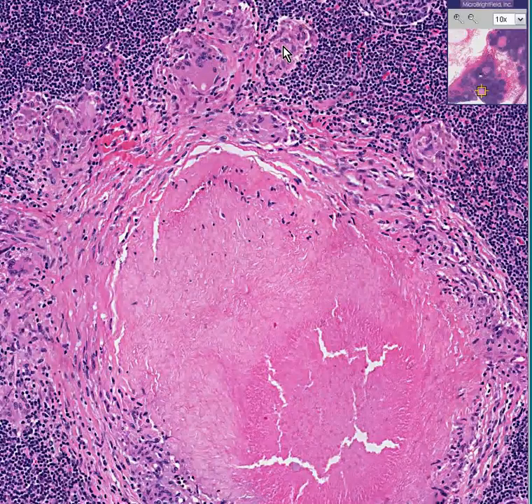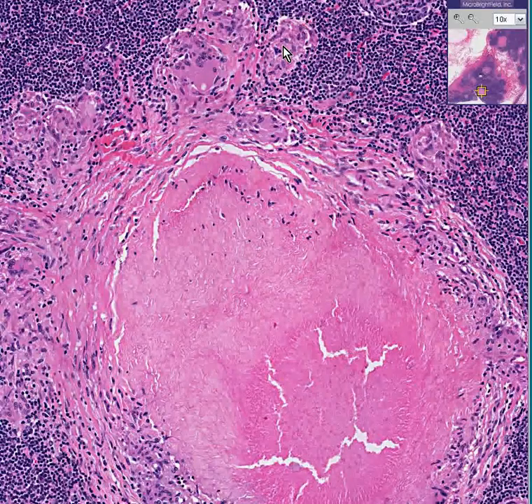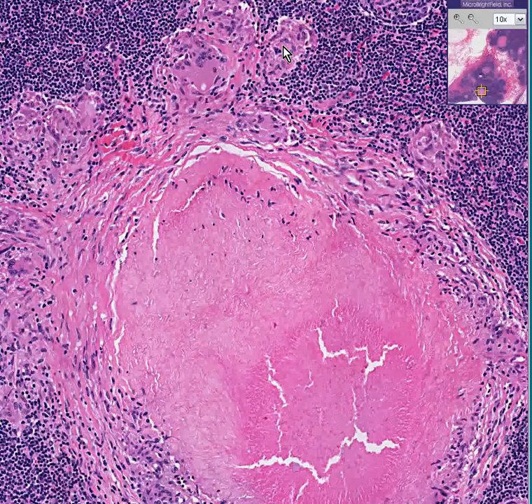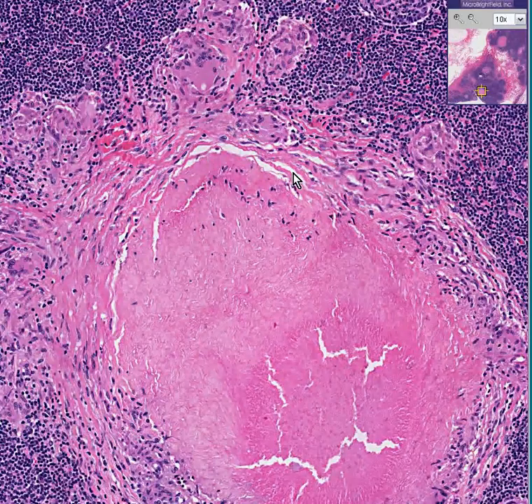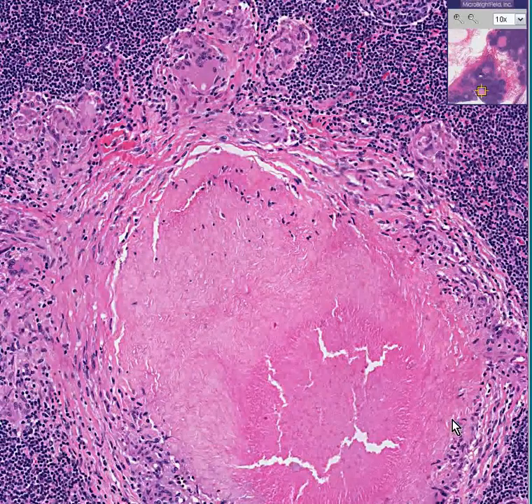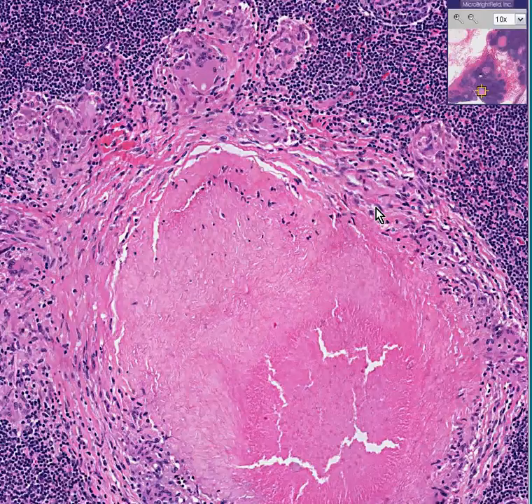The multinucleated giant cells of TB are also often called Langhans giant cells. This is tuberculosis involving a lymph node. If you did a Ziehl-Neelsen stain, especially at a transition between a necrotic area and where you see histiocytes, like perhaps here, you could very easily see the little acid-fast rods staining nicely with the acid-fast stain.